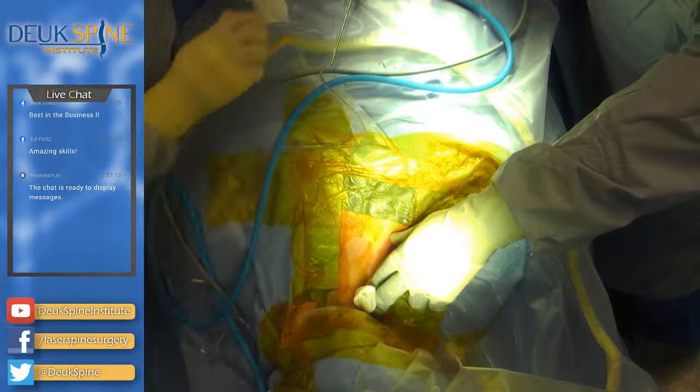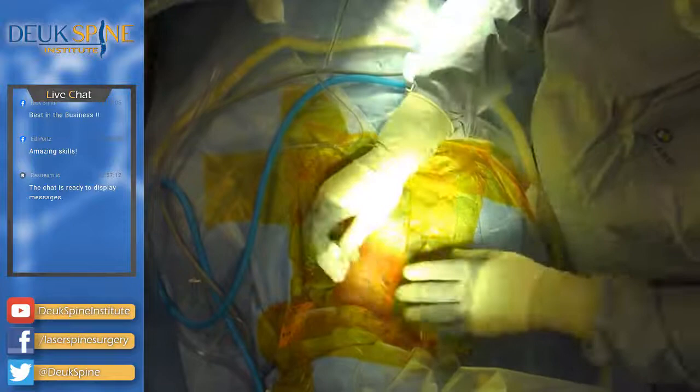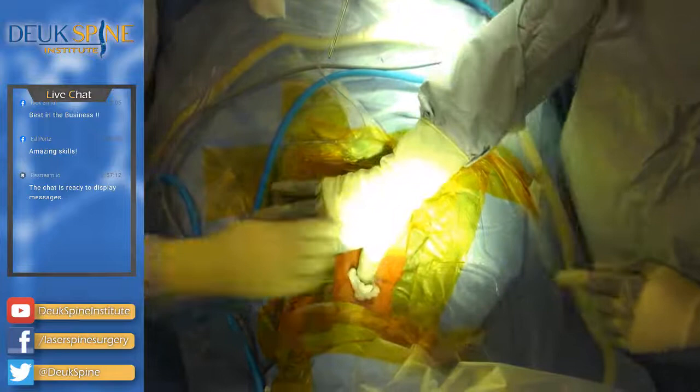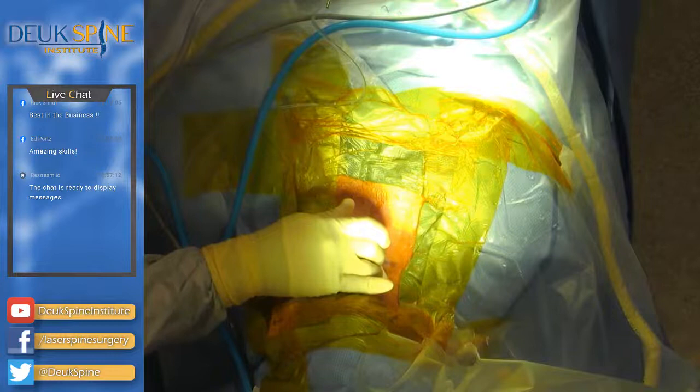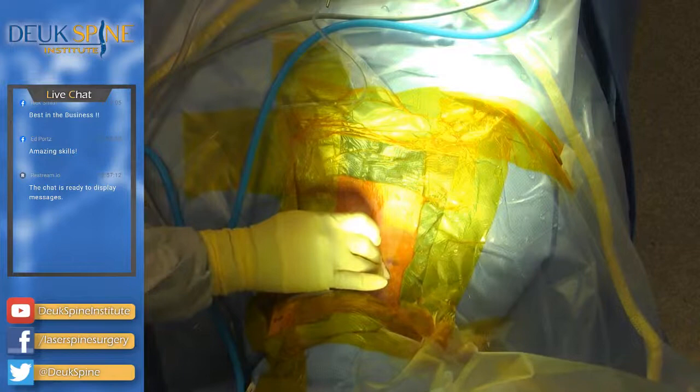We're done. So as opposed to the last patient that had three herniations, all causing pain, this patient has one. And there's the incision, 4 millimeters, put some pressure. And again, we go through the front of the neck with the Deuk laser disc because that's where the herniation is. It's in the front. It's just deep inside. And what it's in front of is the spinal cord. So going through the back of the neck to fix a herniated disc doesn't work. But going through the front does.